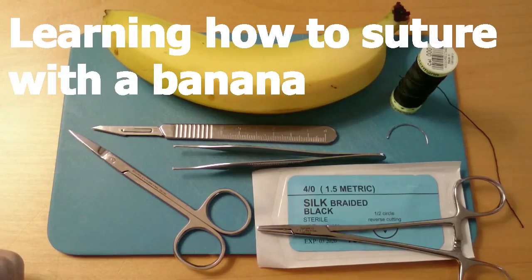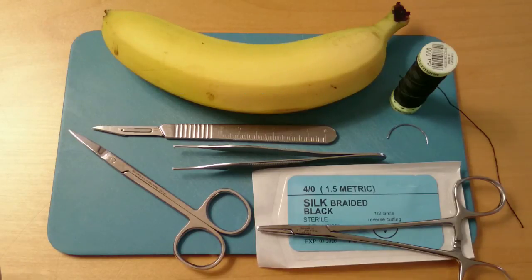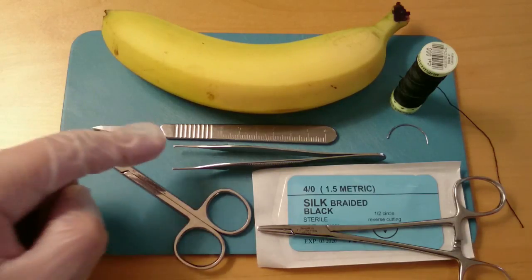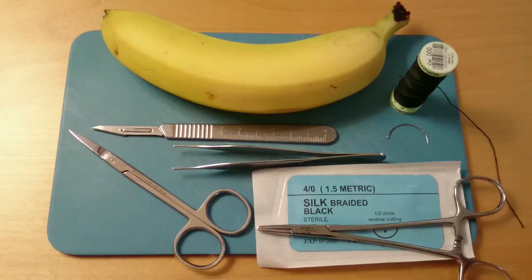This is a basic introduction to suturing technique. I'll be using needle holders as a driver, scissors, tweezers, a scalpel, and a suture needle with prepared thread.